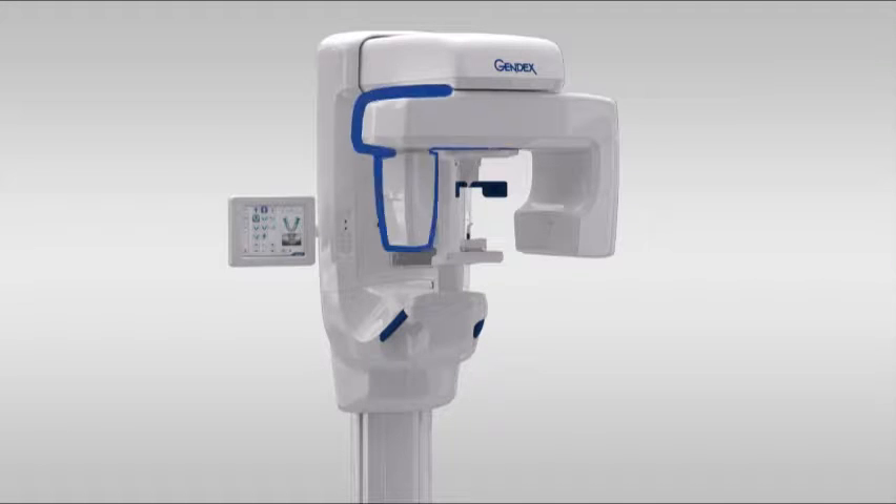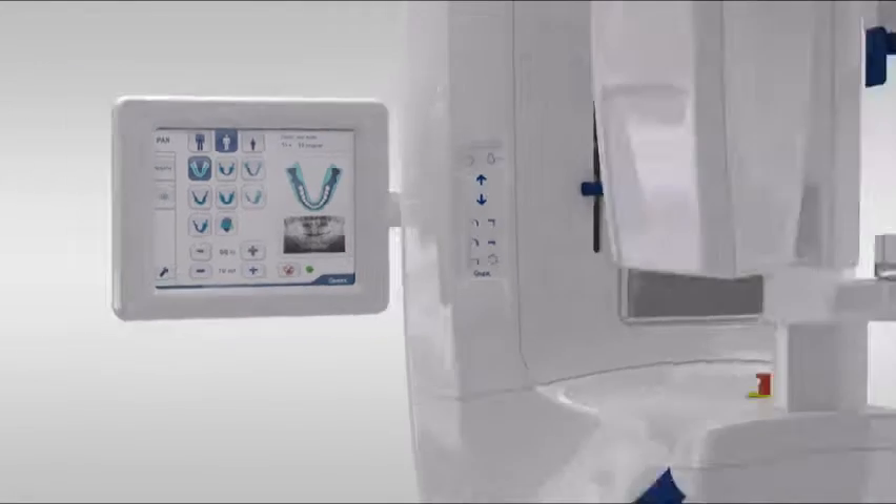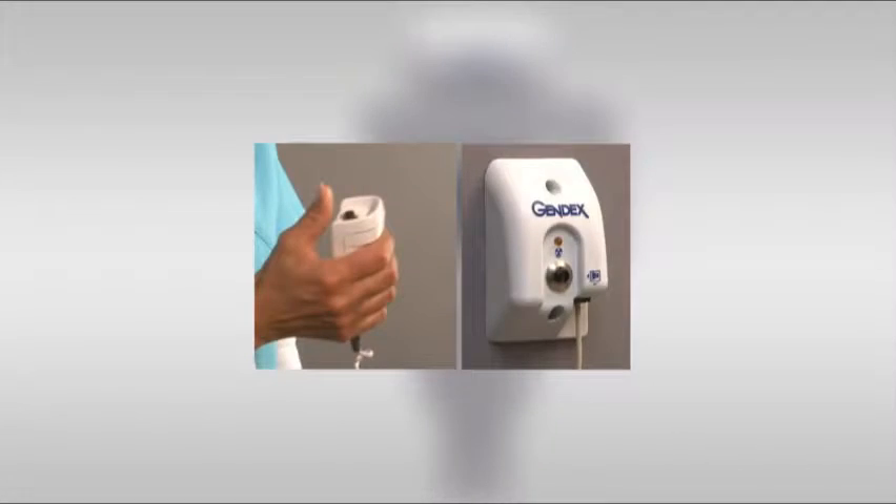Included are the rotating unit, column controls, touch screen, easy position items such as chin support and bite guide, head supports, hand grips, and positioning lasers. Finally, the exposure trigger, which either may be a handheld device or wall unit.